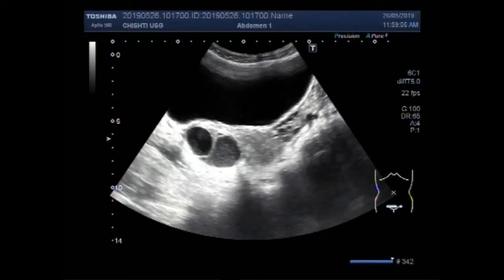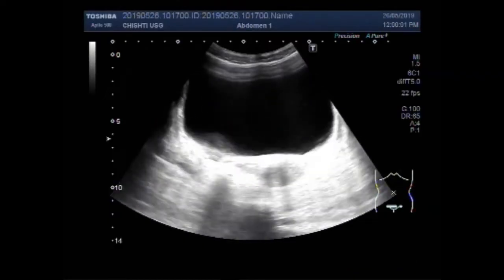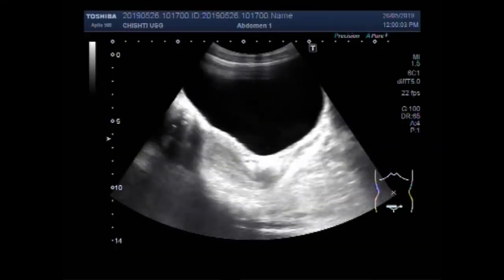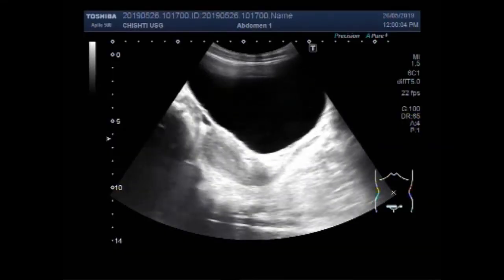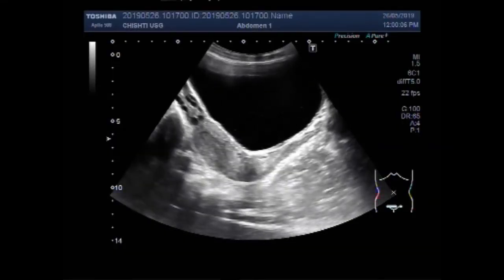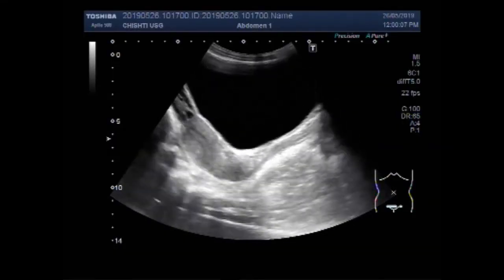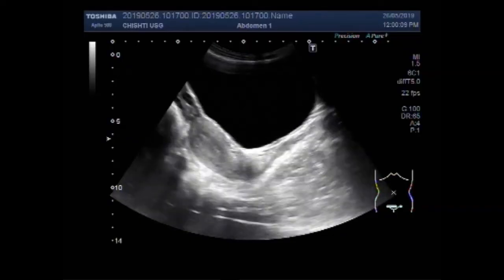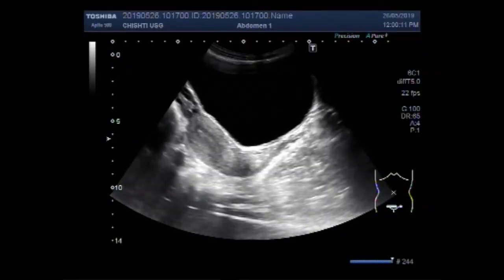Dear viewers, I hope you are all fine. This ultrasound video shows two ovarian cysts. You can see the medial one — the cyst lying medially — has a significant amount of thick fluid in its interior. Now you can see this is the uterus, this is the cervix, and this is the urinary bladder.